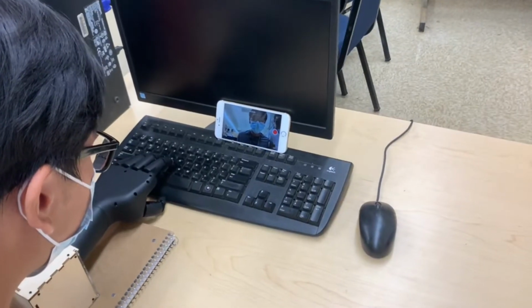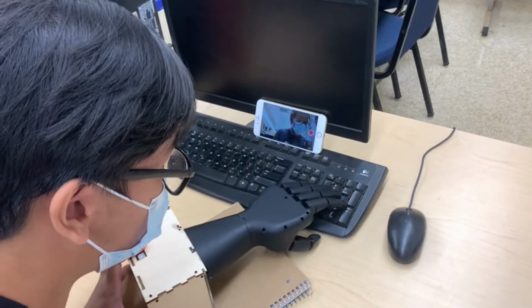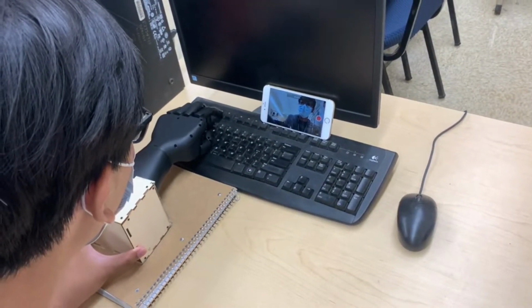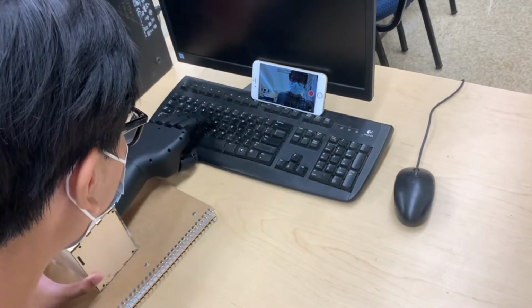As for the keyboard, we will be using an eye tracker or voice recognition to the NeuroMaker hand type the keys. Using the eye tracker, the user will look at their keys and their hand will go towards that letter they stare at for about 5 seconds. With voice recognition, the user will say a word and the hand will type out the word, moving to the keys on the keyboard if needed.